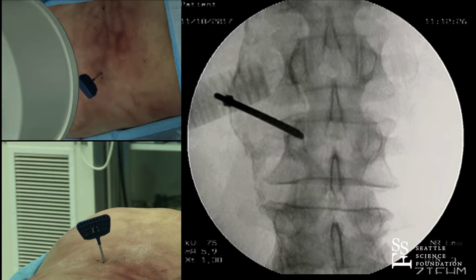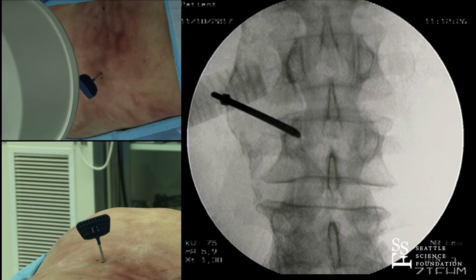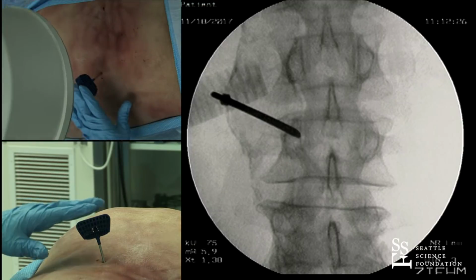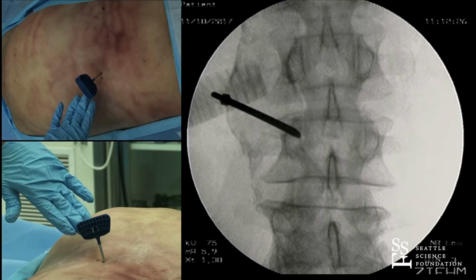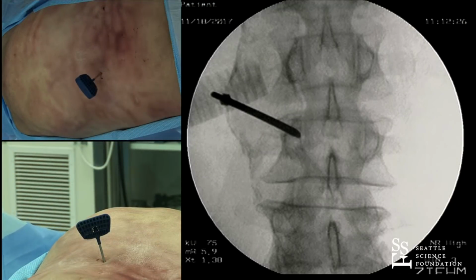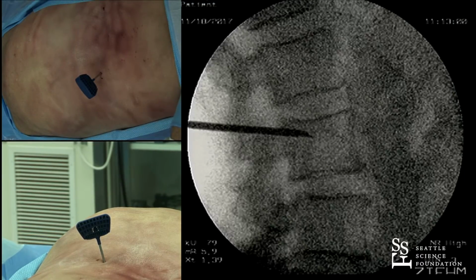Okay, go down 10 o'clock position of the left pedicle down to the medial portion of the pedicle, and before we violate that medial wall, we are right up against that medial wall with the distal tip of the needle. So before we violate that medial wall, we'll make sure we're in the posterior portion of the vertebral body. And at this point in time with the trajectories, you see the needle here, it's relatively steep. It's not flat like the perpendicular approach, and it's certainly a far cry from the almost horizontal position of the modified inferior end plate extrapedicular approach. And so we're looking pretty good at this point in time.